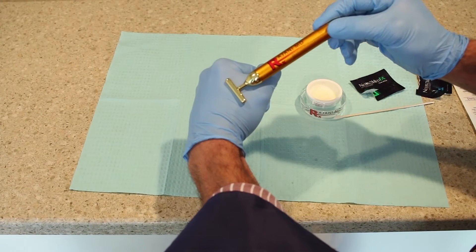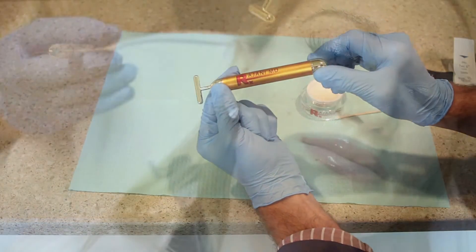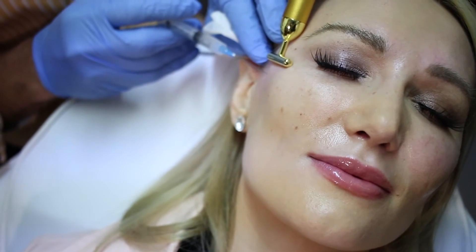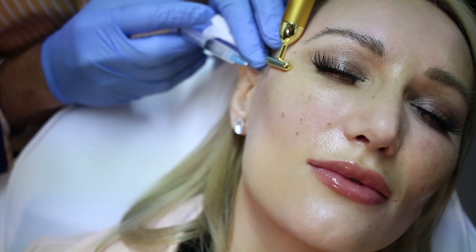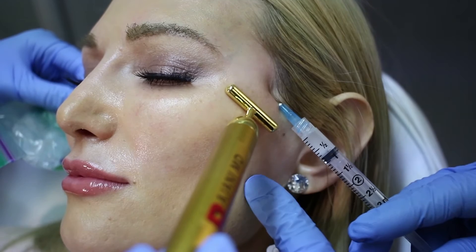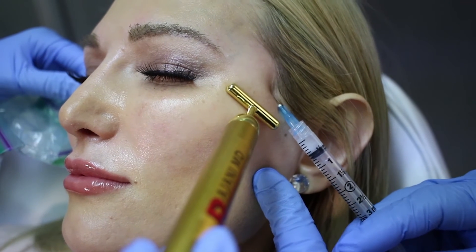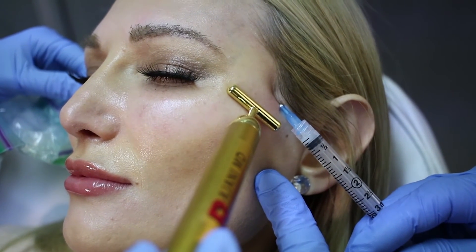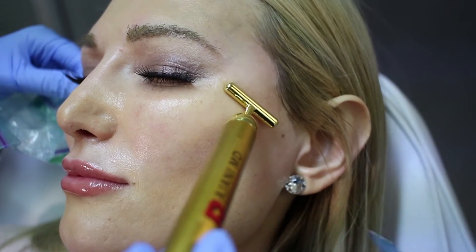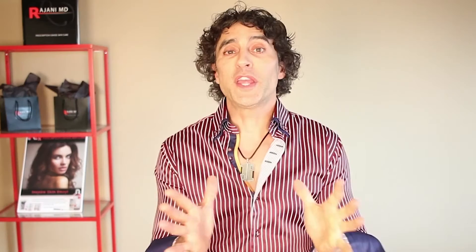There are several vibratory anesthetic devices out there — here I'm showing you one. This works very well because you can use this device in the area where you're going to inject. It works by way of the gate theory of pain: you fire the nerve with the vibration, and then the pain transmission cannot travel down the nerve fiber because the nerve doesn't recover quickly enough after the vibratory sensation. These work amazingly well and I think they're underutilized in aesthetic medicine. There you see a couple of ways to make the patient comfortable.